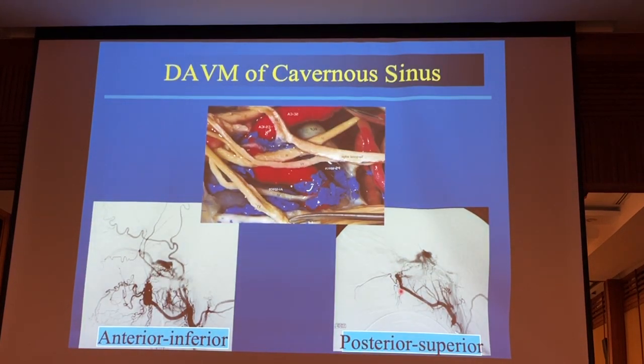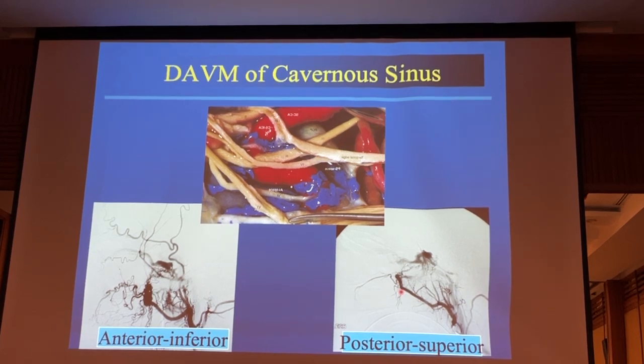Especially, I do believe, as Timo mentioned, cavernous sinus dural AV shunt is one which is quite indicated to use the transvenous approach rather than transarterial approaches because of very dangerous, very common anastomosis with the ophthalmic or internal carotid artery. As Philippe introduced to you, the cavernous sinus can be divided into two major components.